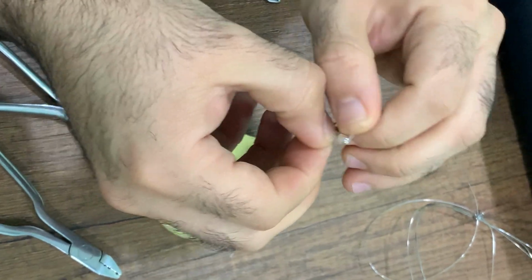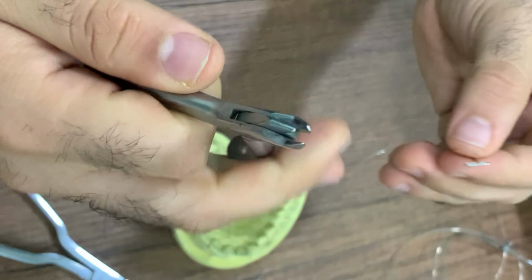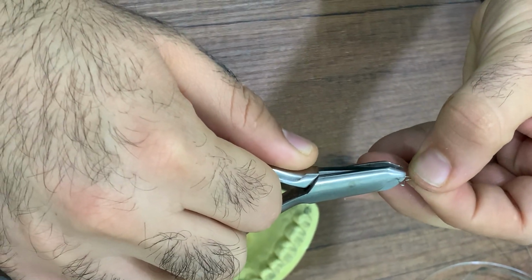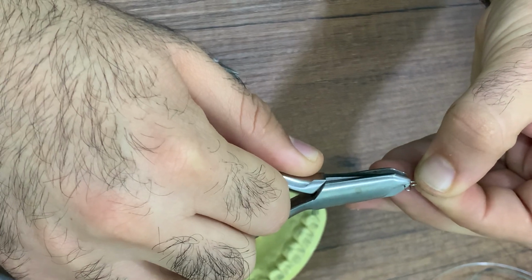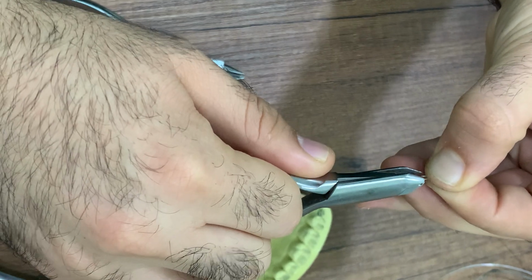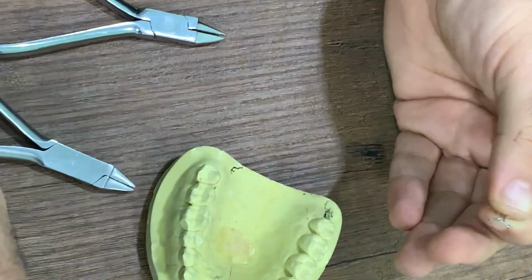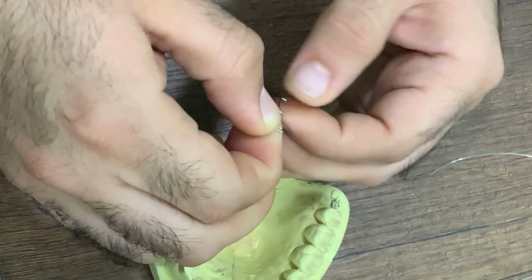This is the T-spring. What we do now, with the 3-prong plier, we make a slight curve on the active arm, to take the shape of the lingual surface of the tooth to be moved, to fit well on the lingual surface of the tooth to be moved.